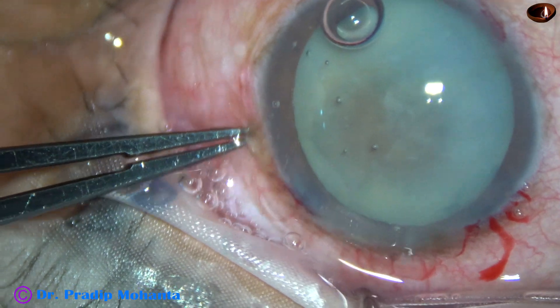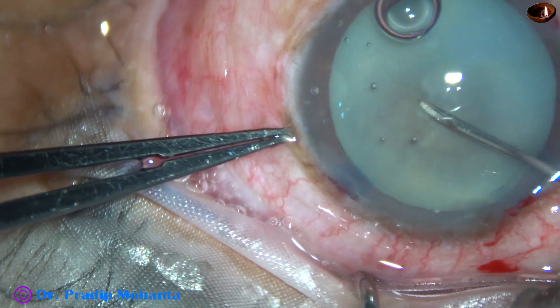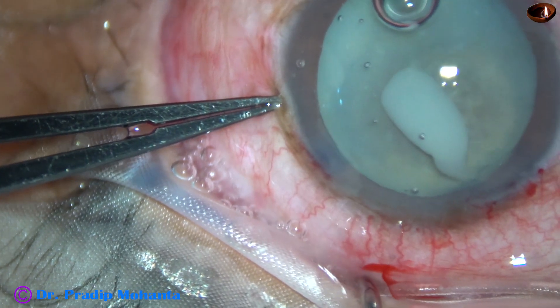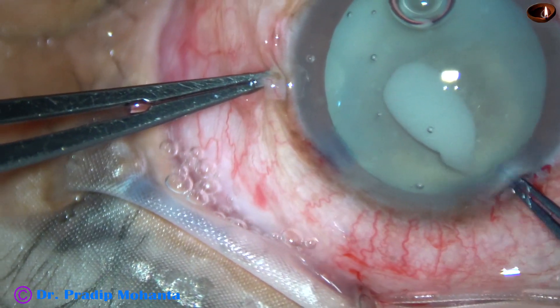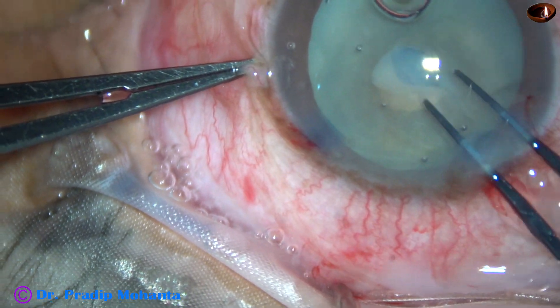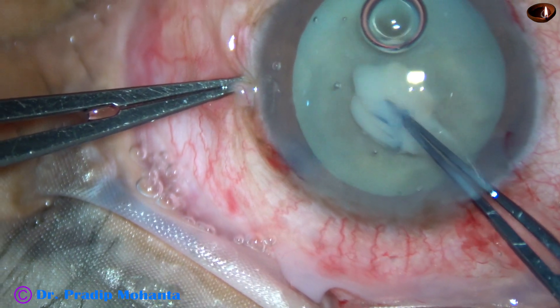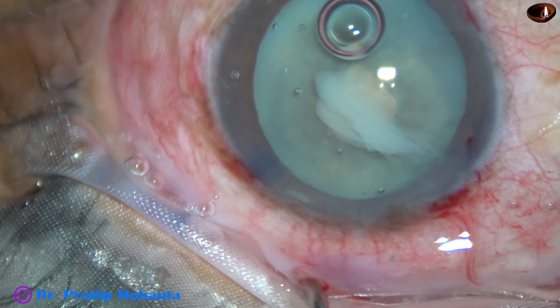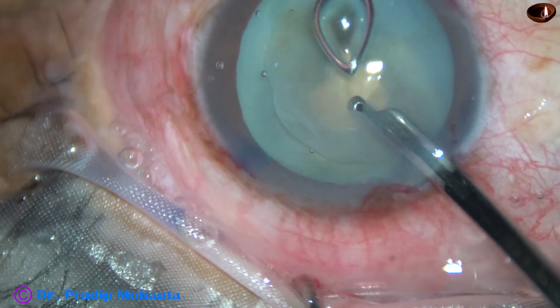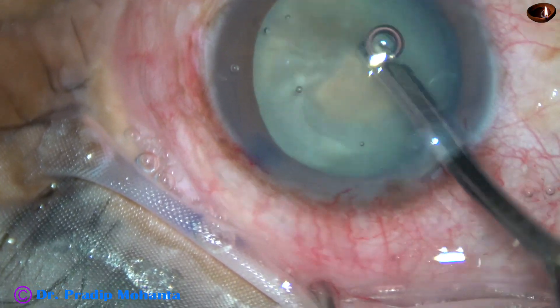And now capsulorhexis. As the anterior capsule is punctured, milky fluid comes out, which indicates this is a hypermature Morgagnian cataract. At this time I could make out zonular weakness. So my next plan is to apply a CTR after rhexis. The milky fluid is aspirated.